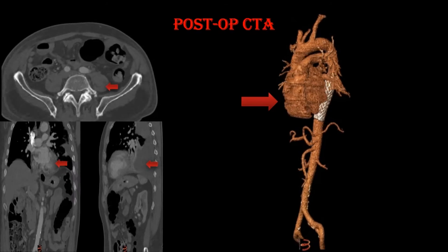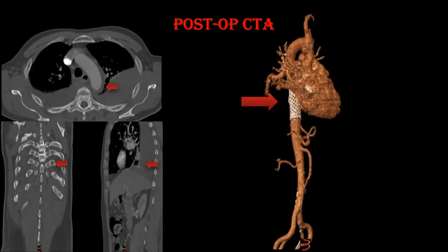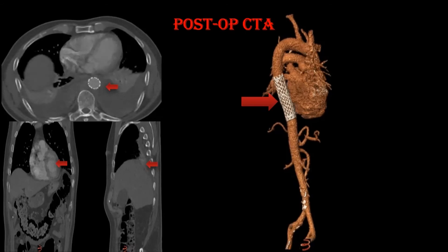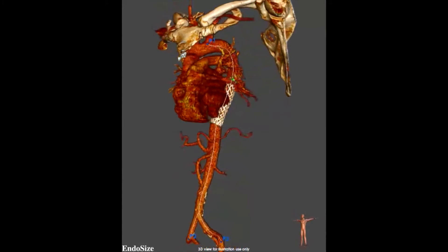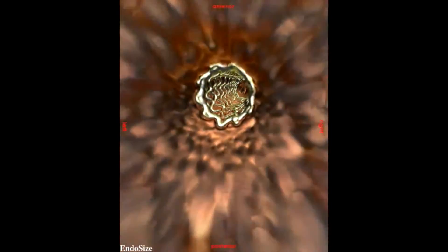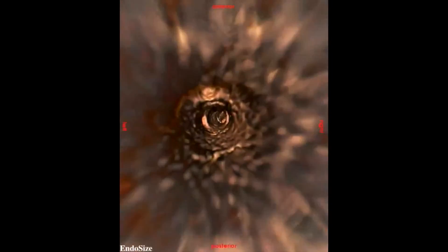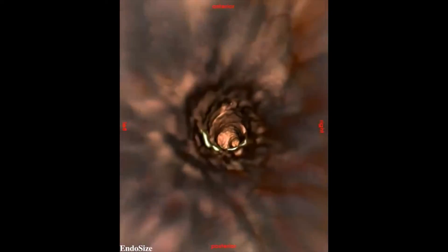Post-operative CT angiogram demonstrated total correction of the transected aorta. This 3D reconstruction utilizing the Endosize software application demonstrates the patency of all visceral arteries. Furthermore, the ability to perform a 3D virtual angiogram by looking inside the vessel confirmed appropriate apposition of the CTAG to the transected aortic wall and ensured full patency of all visceral branches.